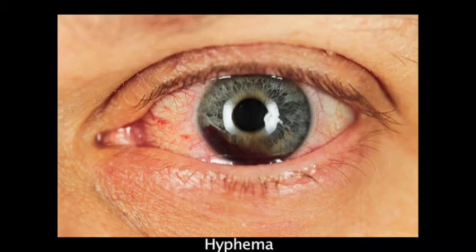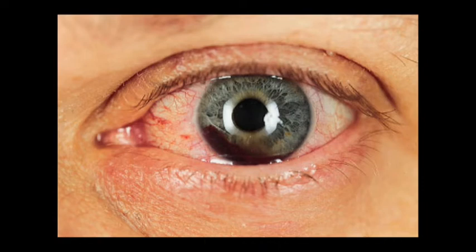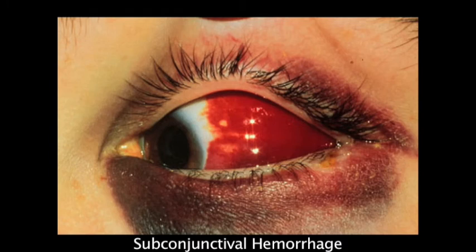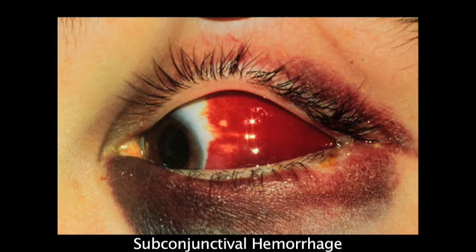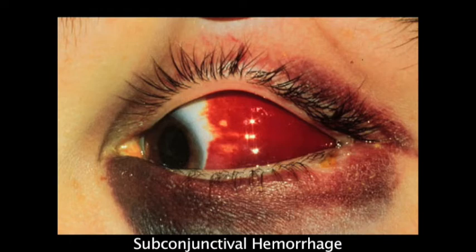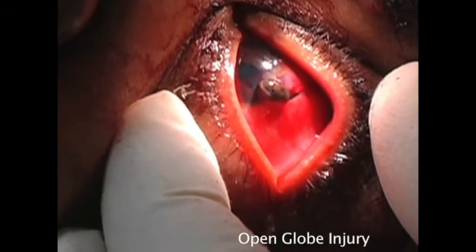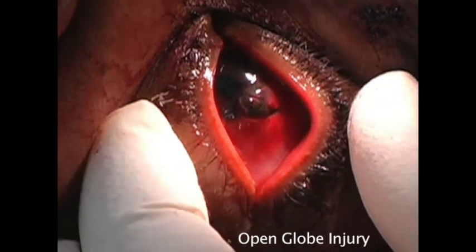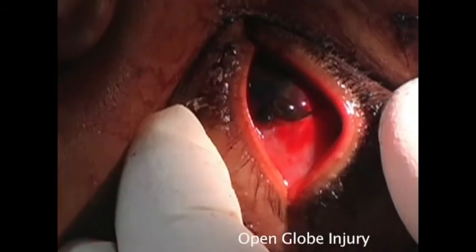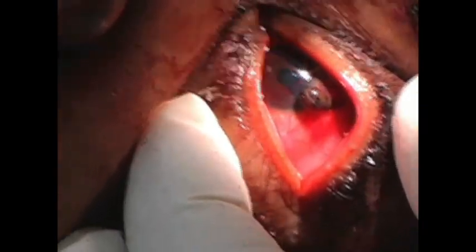If a diffuse subconjunctival hemorrhage is present in addition to the hyphema, suspect a ruptured globe and proceed appropriately. This is a subconjunctival hemorrhage, which represents blood layering beneath the conjunctiva. Note how the redness is solid, unlike the redness seen with conjunctivitis. Subconjunctival hemorrhages usually resolve without problems or intervention. This patient has an open globe injury. In this case, iris protrudes through the laceration of the cornea. A loss of the roundness of the globe, a defect in the pupil, or streaming of fluorescein from the base of the foreign body are all signs of an open globe injury, which is a surgical emergency.